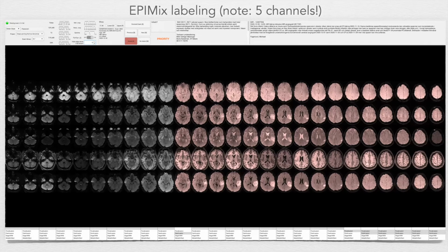Also, up there it is now in Swedish, but it doesn't matter. We have the full radiology report for all these 2,000 patients. So we know the true answer for the patient in this labeling phase.